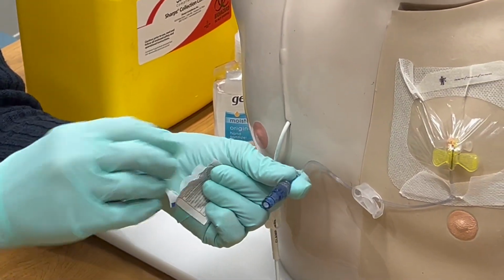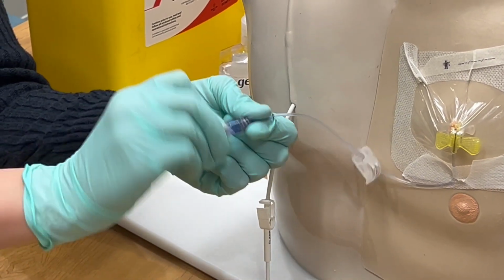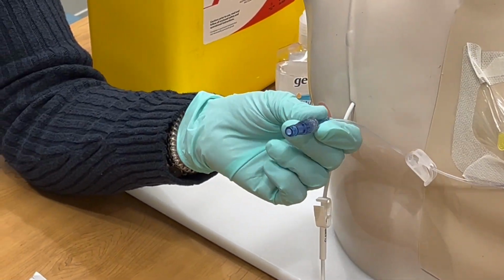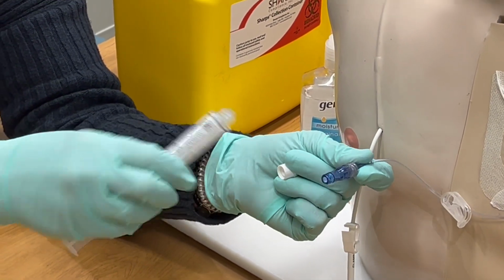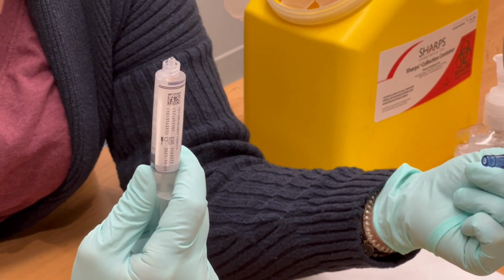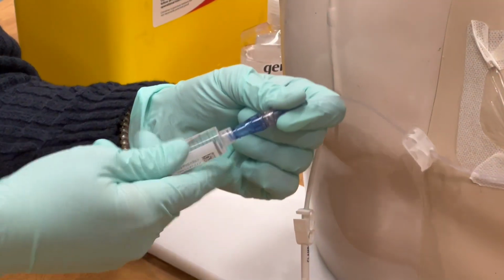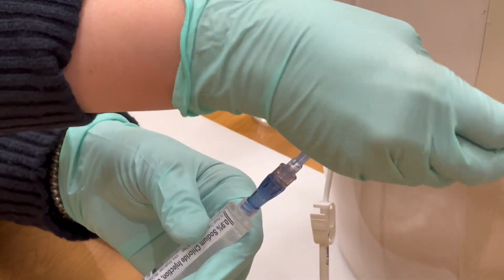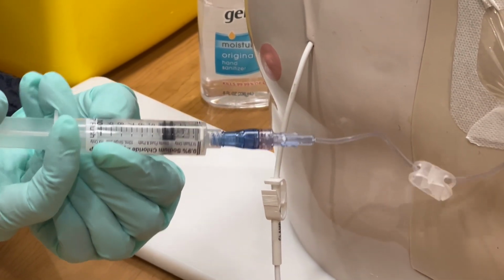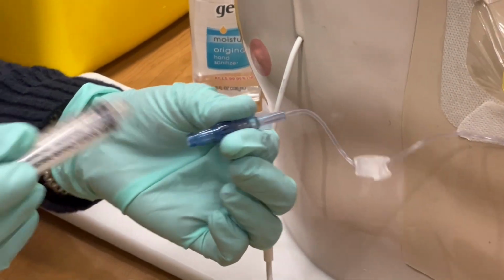We're going to take a new alcohol pad and clean the end. So each time you connect to the needle, we're going to make sure we clean it with a new alcohol pad for 15 seconds. And then we're going to let it dry. And while it's drying, we're going to get our flush ready. We're going to pull down on the plunger to break the seal and then slowly push up to get the air out of the syringe. Next, we're going to push and twist the syringe onto the end of the needle. Open up our clamp and flush again with a push-pause technique. Close the clamp and disconnect the empty syringe.